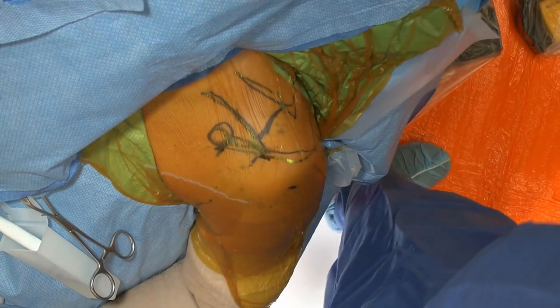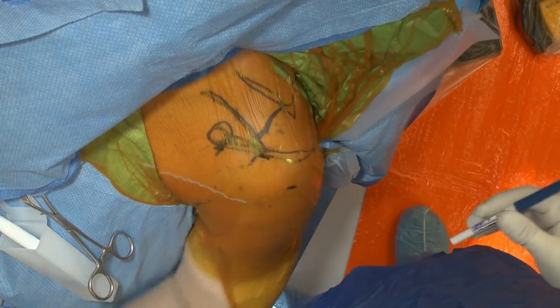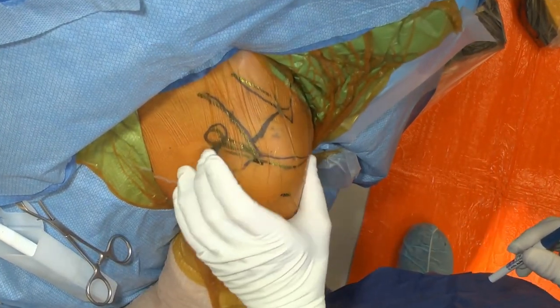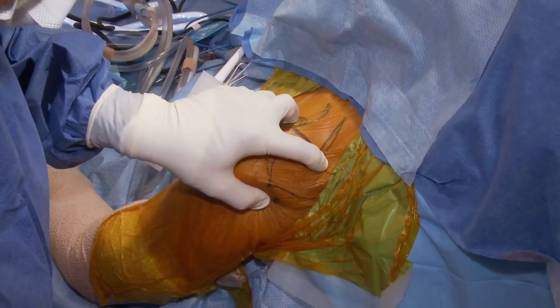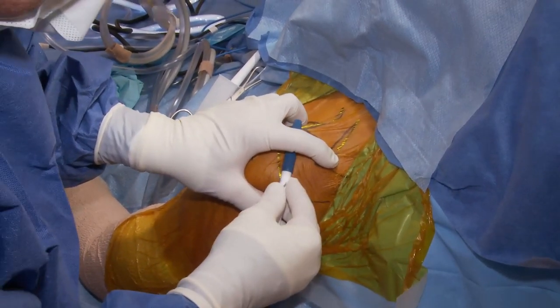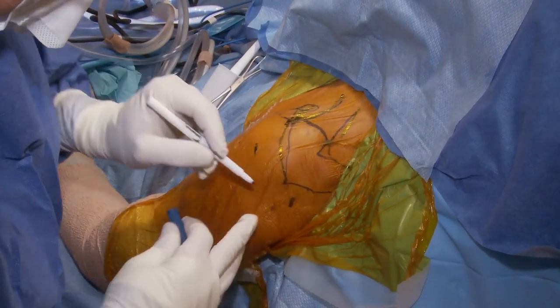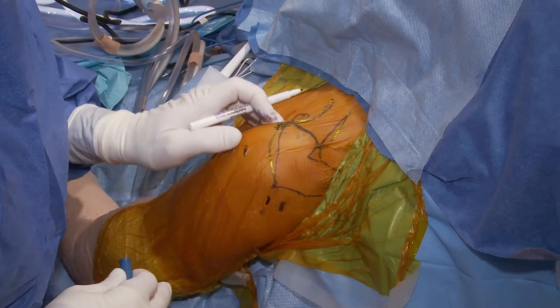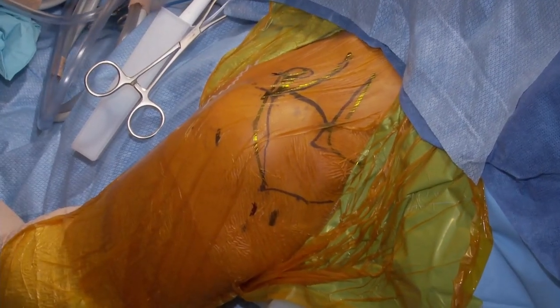So for our portals, again, we have the acromion. I like to put my index finger and thumb on the anterior and posterior aspect of the joint and move the joint back and forth. I'll move my index finger to the sulcus between the clavicle and the spine, and this will give me my alignment of my joint. If I want to go straight into the joint, I can go directly in that plane, but I like to come just a little bit lateral so that we have better access to the glenohumeral joint. Just off the edge of the coracoid, and then usually approximately 2 centimeters below the acromion, will give us the portals that we need to conduct this procedure.